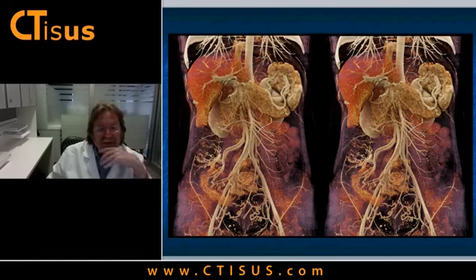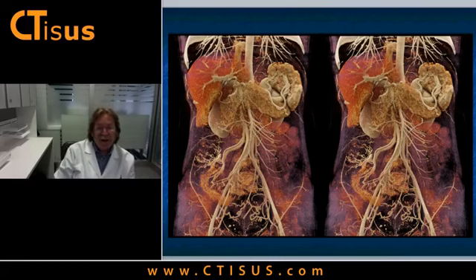But with the cinematic, now I didn't have a chance to show you video, so we now can do things on the newest version where I can make video loops. Before, when you moved, it would always downsample. Now the video kind of sets the sampling and you can get really good looks. And so I find that very helpful.